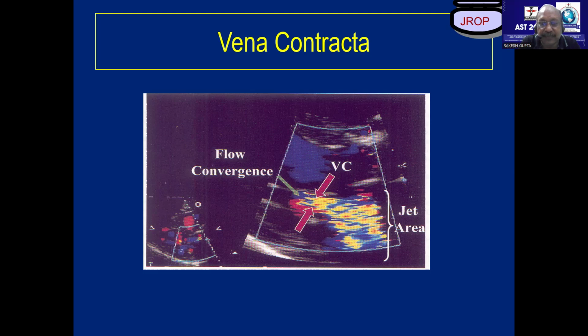Yeah, got it. Now you got it? But I thought this means the area of the regurgitant jet will be more. That wind, if we are comparing, sorry, sir. Correct. But the orifice where we see the color that is present during regurgitation will be the same, sir. The same colors would be there, but those colors you can only measure because that is the hole through which the blood is regurgitating.